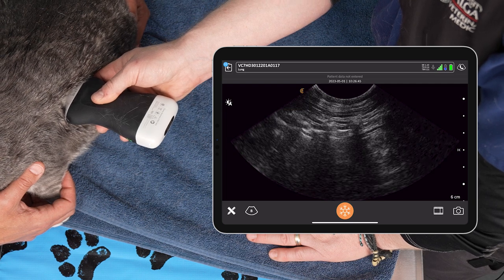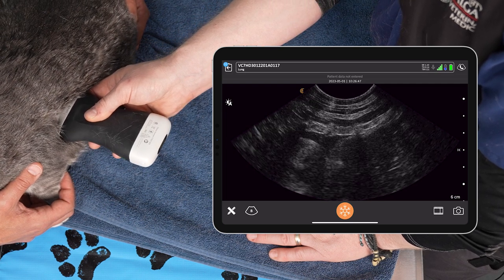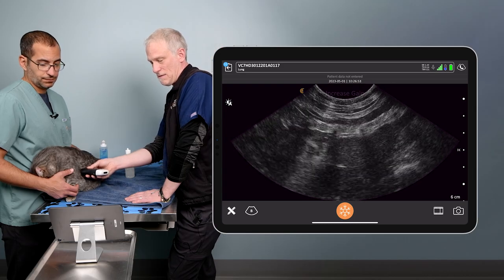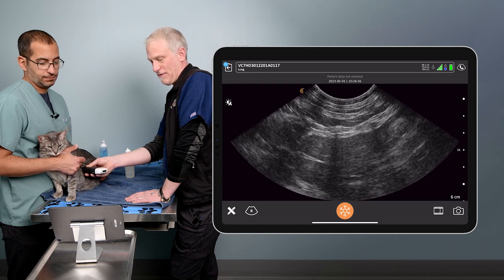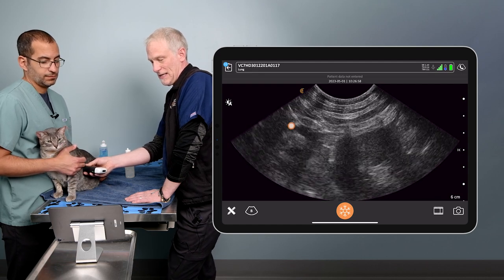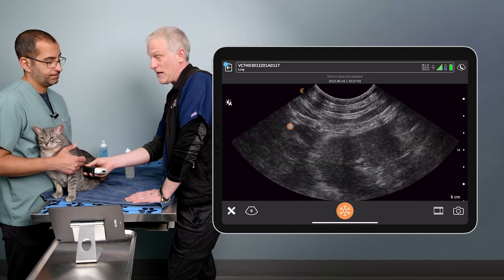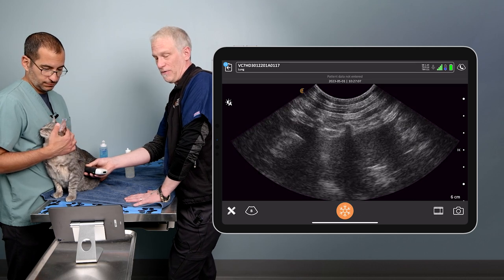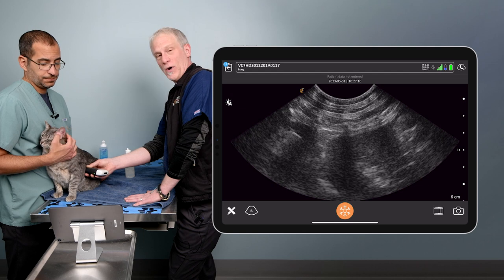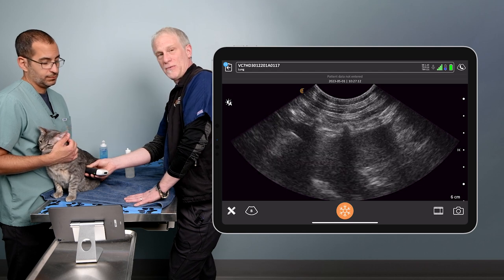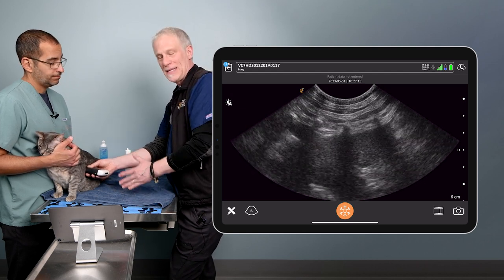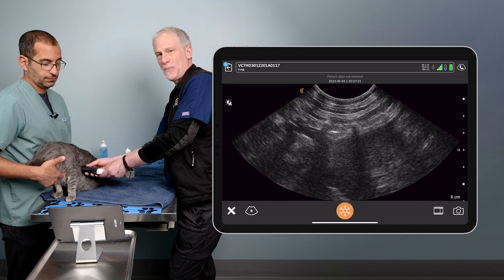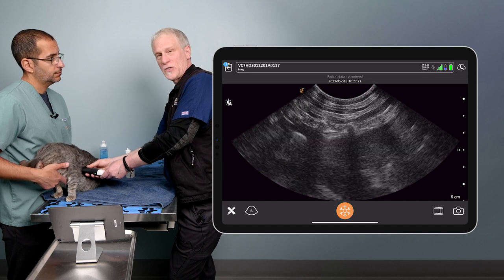Once we see the curtain sign we're in mid thorax. We now drop down following that curtain sign until we put the heart and diaphragm in the same window. You can see the heart to the left, the diaphragm to the right, and that little mediastinal triangle between them. This is a great spot to differentiate pericardial or pleural effusion in feline patients — if the patient is clinical for pericardial or pleural effusion, we'll definitely pick it up at this site. If we're worried about missing a small or scant amount of fluid, research shows that turning the probe parallel to the ribs and dropping down to the ventral sternal muscles will increase your chances of finding very small amounts of fluid that aren't going to be therapeutic but may be diagnostic.